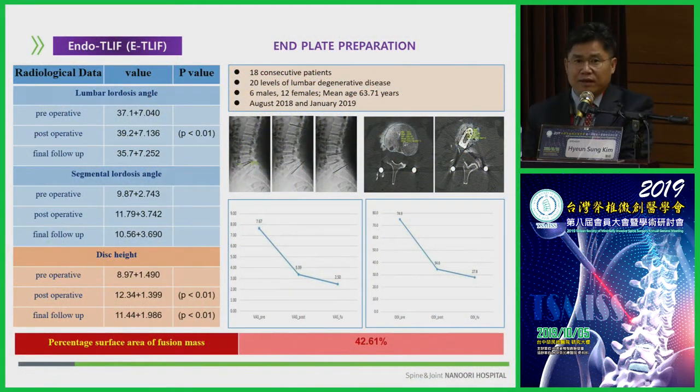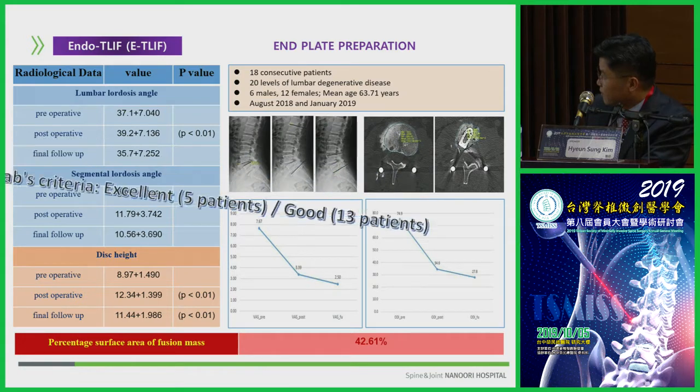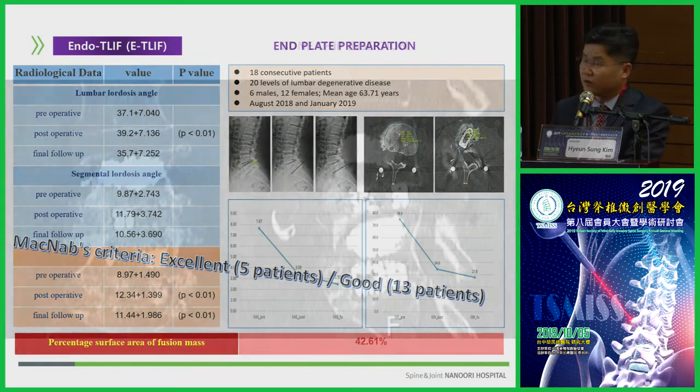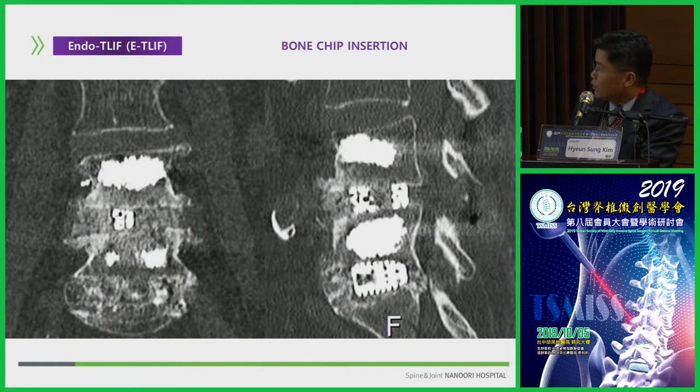I performed nearly 50 cases of endoscopic fusion surgery, and I reviewed nearly 20 cases followed for more than 6 months. All patients had good to excellent clinical results. Also, the percentage of bone chip filling there is near 50%, which is sufficient for fusion. For example, in this endoscopic fusion case, we can insert the bone chip through the working channel. We can insert the bone chip sufficiently to achieve endoscopic fusion success.